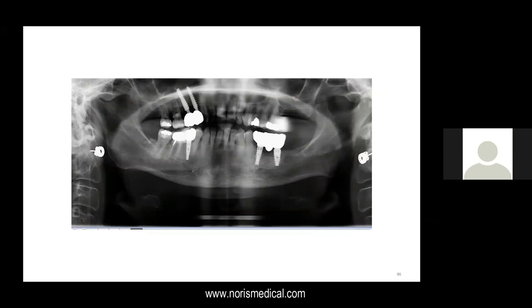Here is the result. As you can see, the neck in this implant is always by definition an undercut. So we never go below. Only if you have a really special case and you have to make the neck of the implant and the abutment the same width. Otherwise, you don't go below the neck, because you don't pass the undercut.